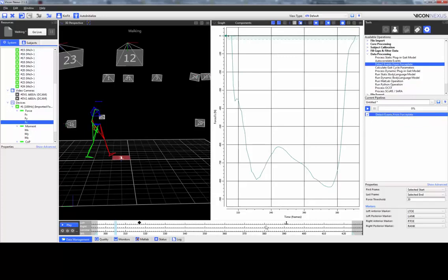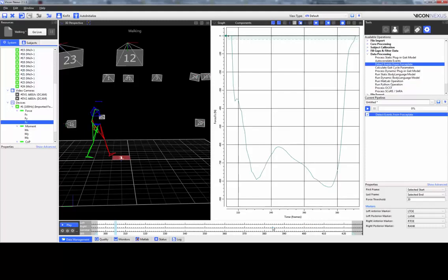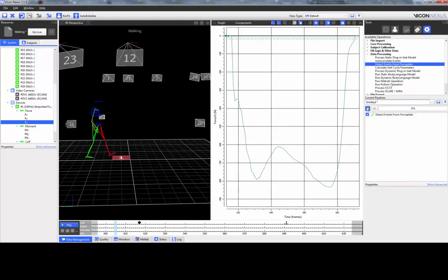In this example, I'm going to clear my events and change my left posterior marker from the left ankle to the left heel. When I run the pipeline operation, we can see that the foot strike and foot off events for the left foot have been put into place automatically.